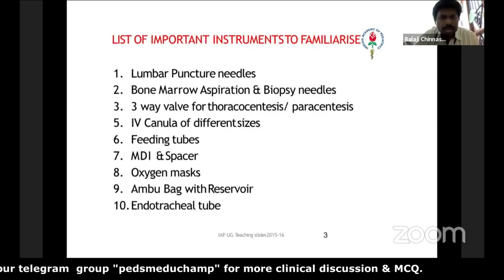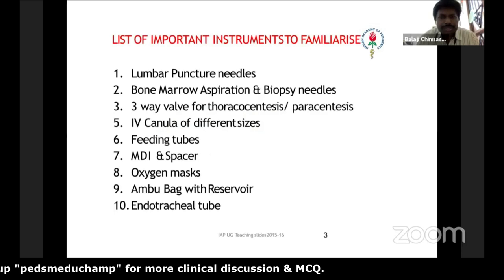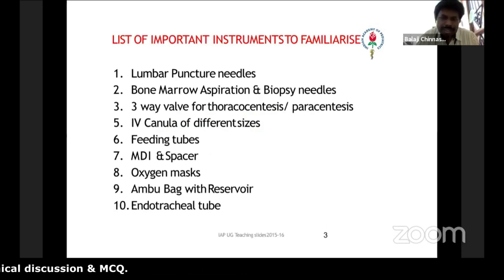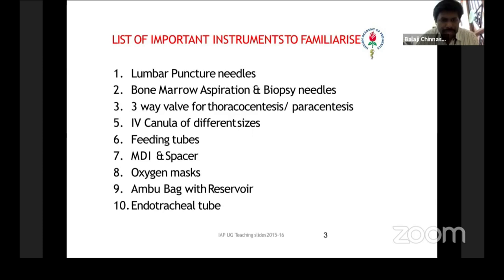There are some important instruments which we need to be familiarized with. One is your LP needle, bone marrow aspiration needle, bone marrow biopsy needle and thoracentesis, paracentesis using three-way valve, IV cannula, NG feeding tubes, metered dose inhaler with spacer, oxygen mask, Ambu bag with reservoir, endotracheal tube, and other instruments which I will be dealing with.